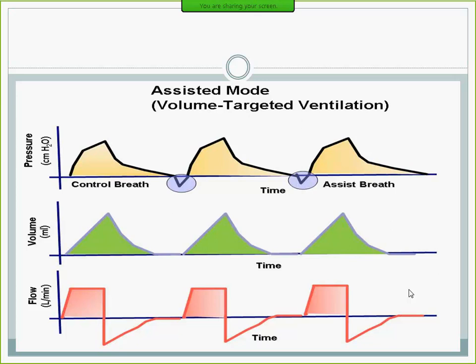One of the answers I usually get when I ask residents, how do you know a patient is breathing along? You look at the pink sign. So in the machine we have here, it shows a pink sign that the breath was initiated by the patient, but we are getting new machines now. Actually, Woodhull got 28 new very fancy ventilators, each ventilator is $30,000, so we are getting 30 of them. And those machines don't have the pink sign. So you should familiarize yourself with what is actually going on.